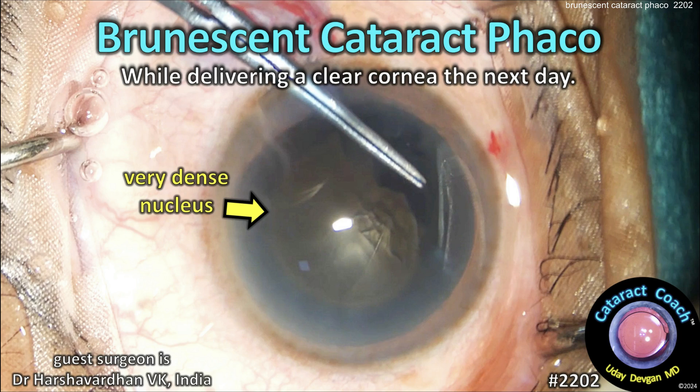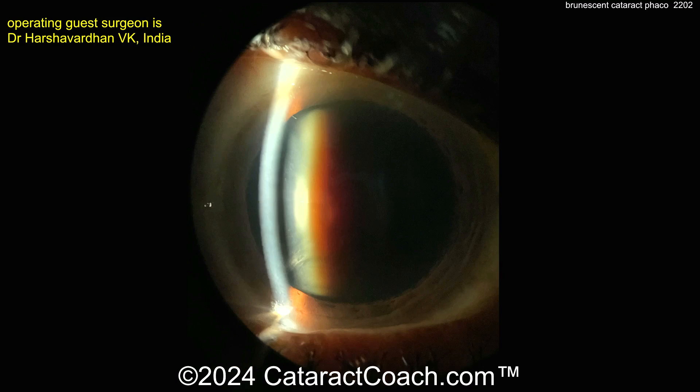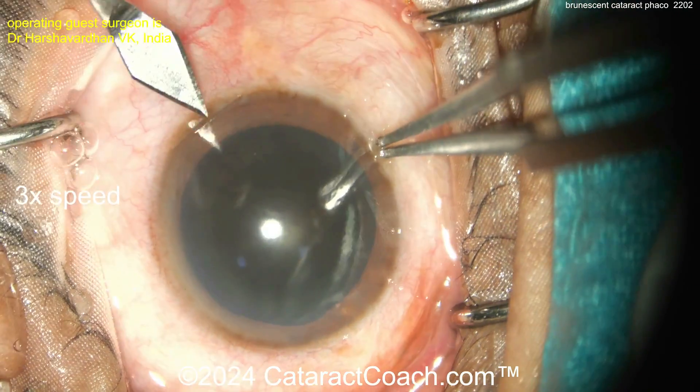CataractCoach.com: brunescent cataract phaco while delivering a clear cornea the next day. This is pretty impressive — look how dense this nucleus is. A lot of density there. Look at the slit lamp view: brunescent, brown, root-beer colored.